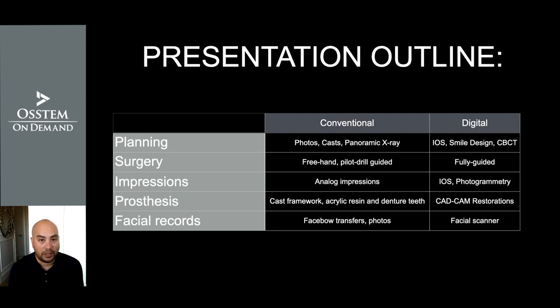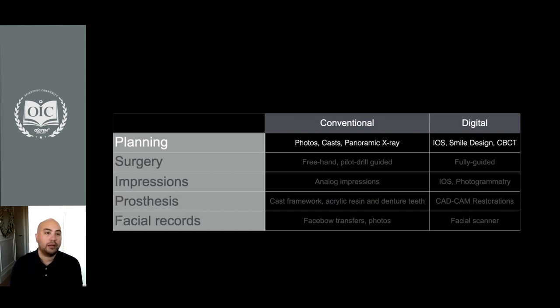This is the presentation outline. I'll be covering the current shift from conventional techniques to digital protocols in complete arch implant restorations, specifically in planning the case, in carrying out the surgery, in taking the impressions, in fabricating an interim and definitive prosthesis, and in obtaining facial records. I'd like to begin first with planning a full arch implant restoration.